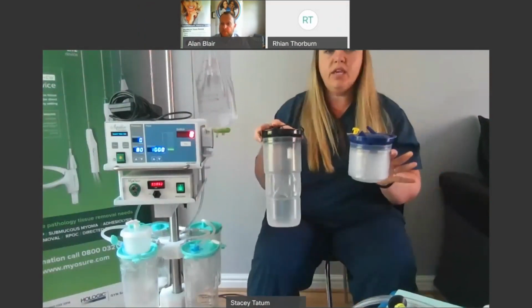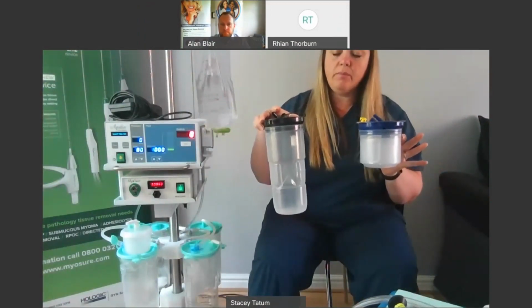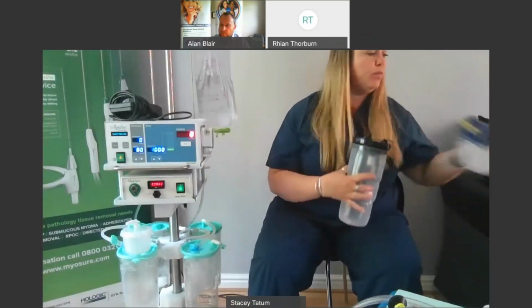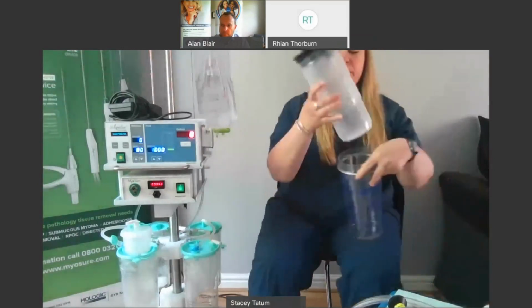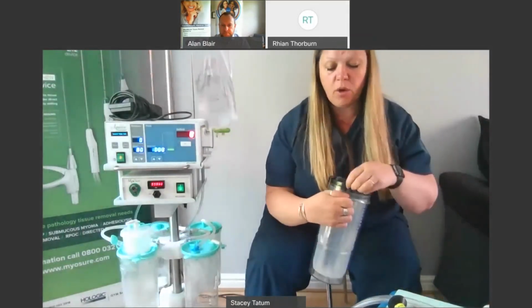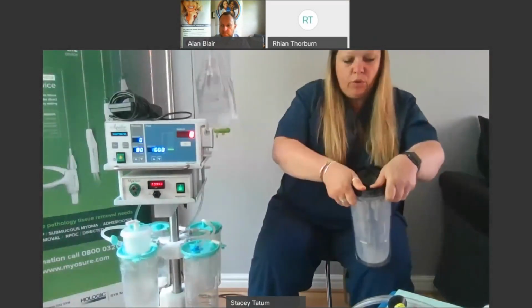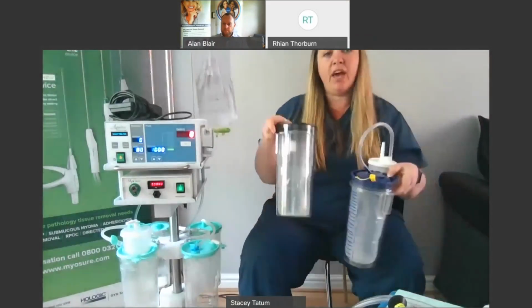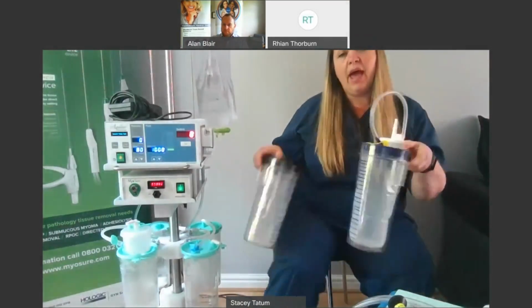When you get the canisters, they will come to you like this, and you'll need to manually pull them down before you put them into your rigid canisters, and you can line up the holes with those as well if you want to. Just make sure they're sealed down nice and tight. And like I said, you'll have black at the back and blue at the front.